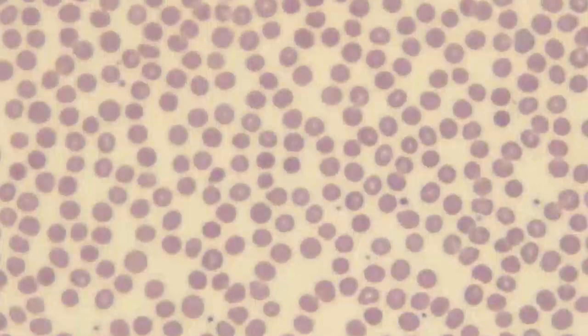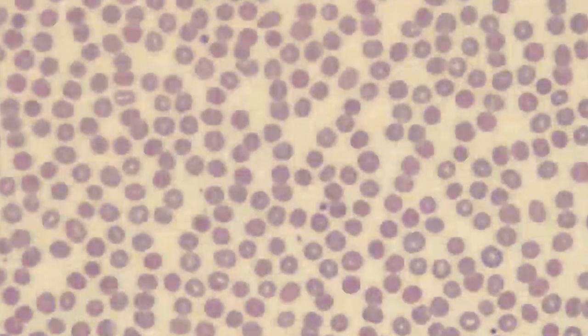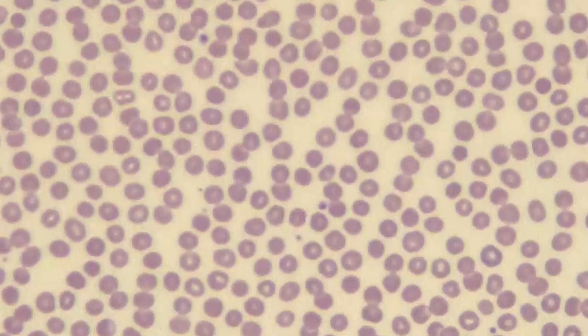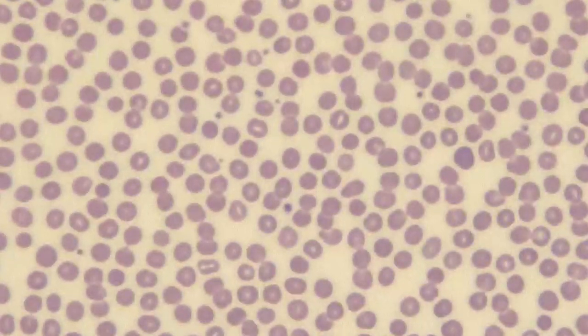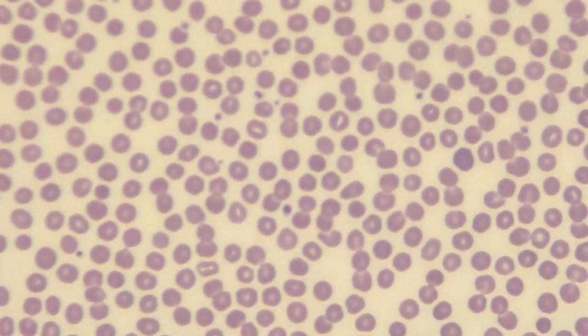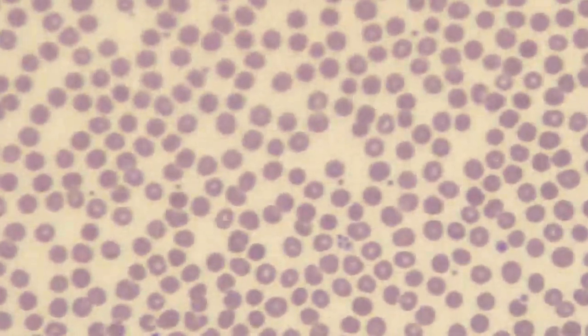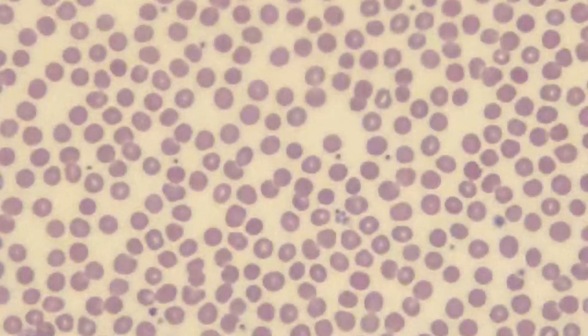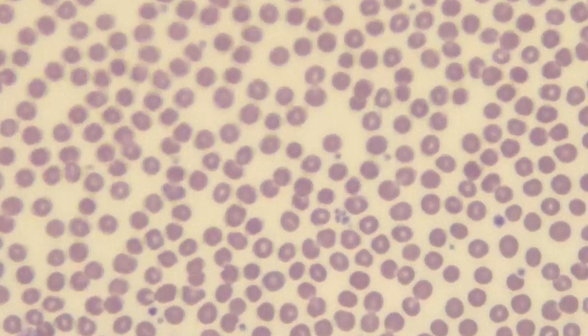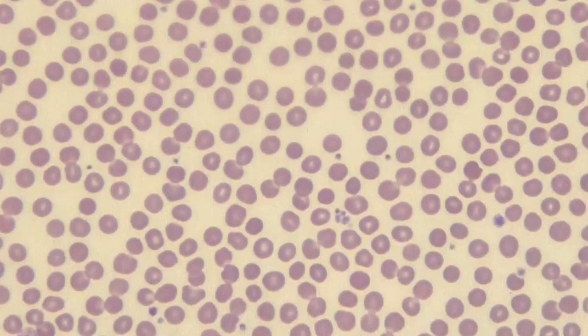But I like to assess platelets on 40x rather than 10x. And we can see here, in the center, some platelets, and it looks like an even distribution. In the very center here, I can see a clumping of maybe about 6 platelets, but in looking at this entire slide, I haven't really seen that anywhere else, so I'm not really going to get too excited and call platelet clumps.